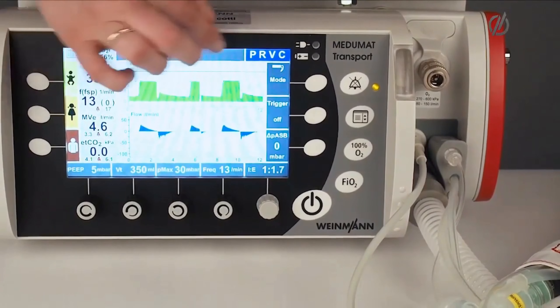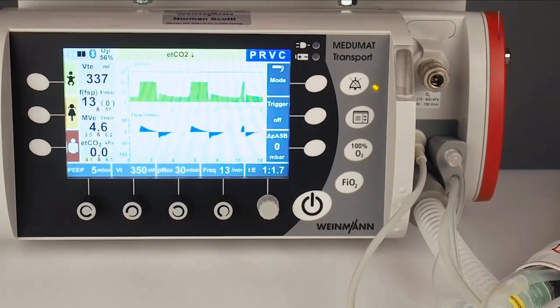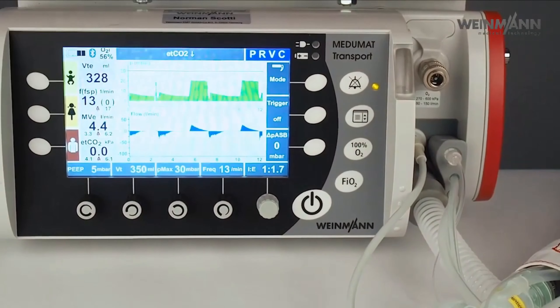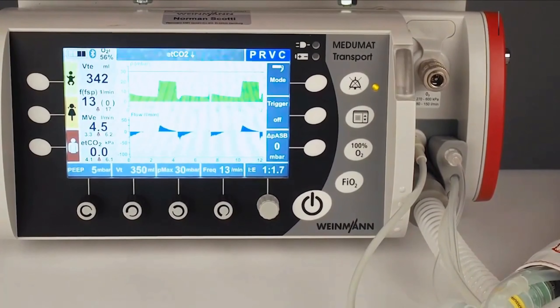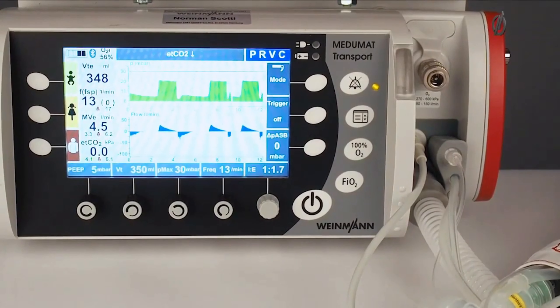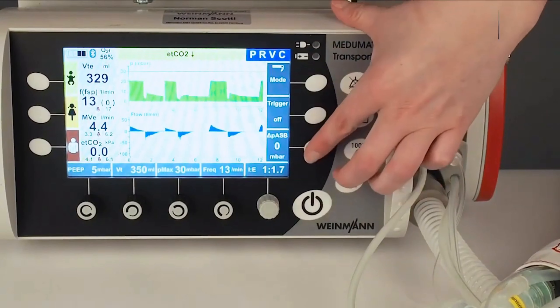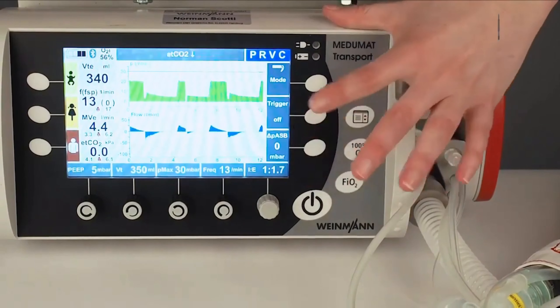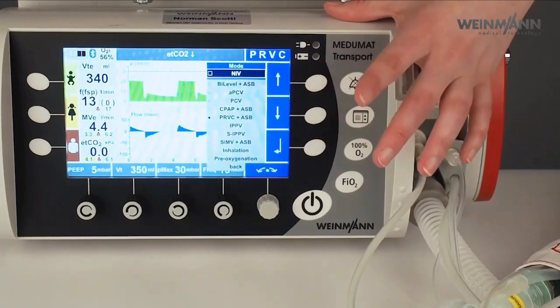On the top you have the status line showing the battery status and the ventilation mode. Here you can also see the alarms — in this case an end-tidal CO2 alarm because we don't have a patient who exhales CO2. Here you have the possibility to do further settings in this mode, such as pressure support or the trigger, and also here I can change the ventilation mode.